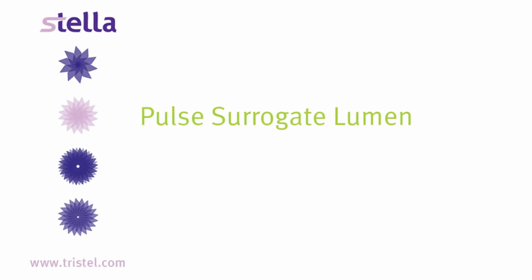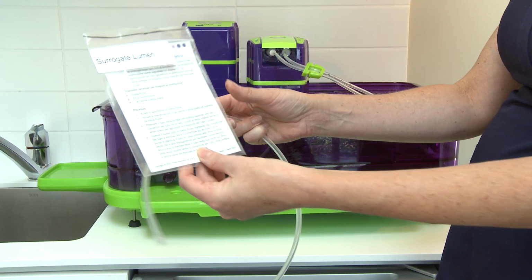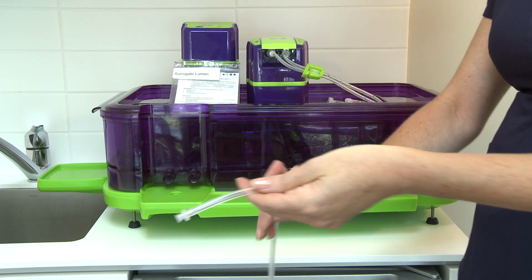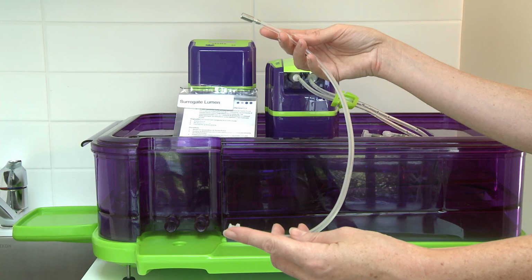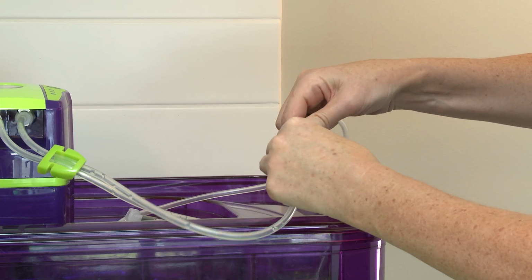Pulse Surrogate Lumen. This is the Stella Pulse Surrogate Lumen. Non-lumen instruments and single-lumen instruments can be disinfected in Stella. If you have an instrument that does not have a lumen, you must provide a surrogate. Connect the Pulse tube set to the surrogate lumen. Without it, Stella will not work.